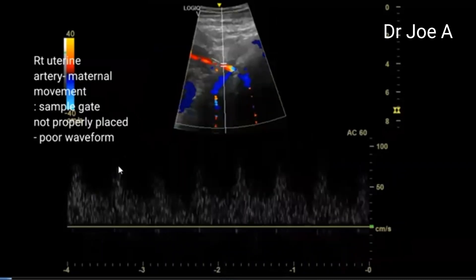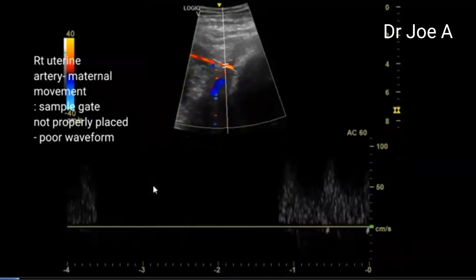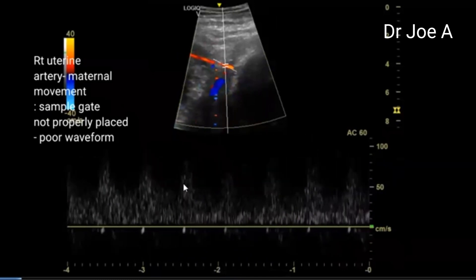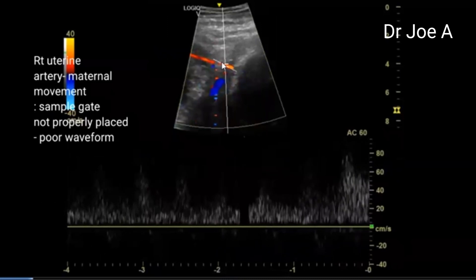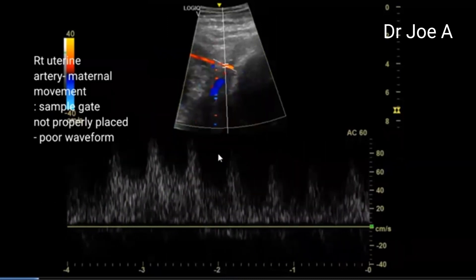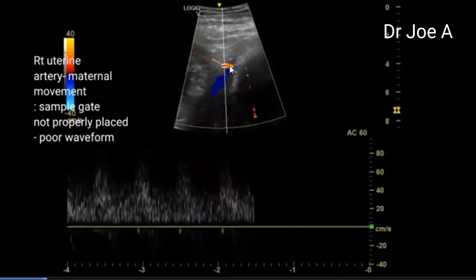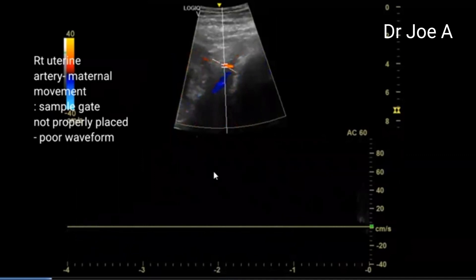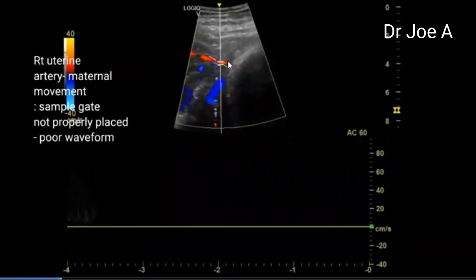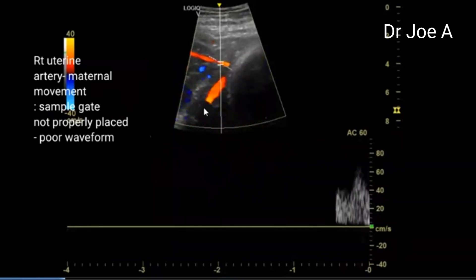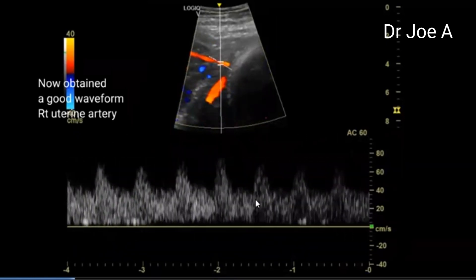Now we look at the spectral Doppler tracing. Initially, due to maternal respiratory movements and the mother fidgeting, we had a poor waveform. We tried to get a waveform on the right uterine artery, but there is slight movement and the waveform is not good — the sample gate is not exactly over the uterine artery. After repeated attempts, we finally got a good uterine artery waveform on the right uterine artery.